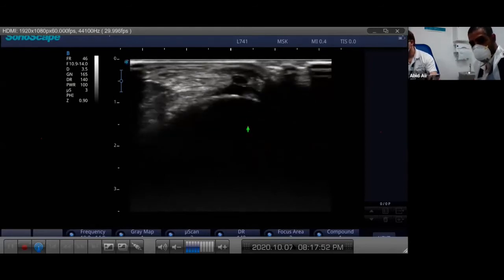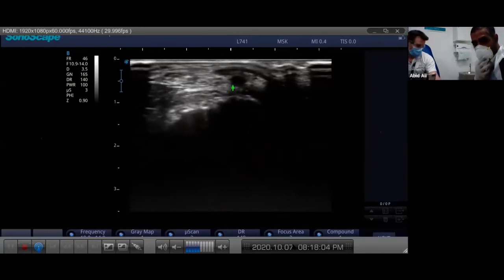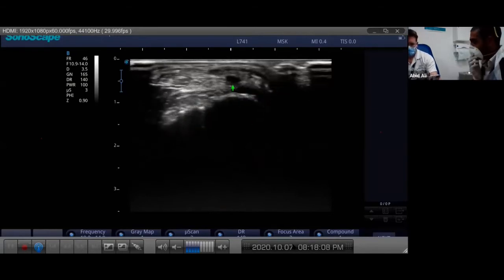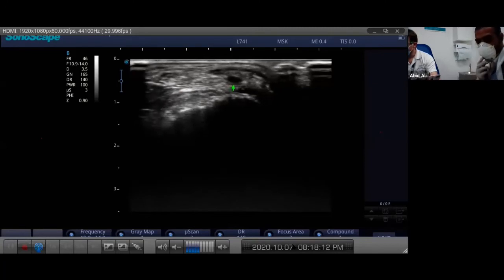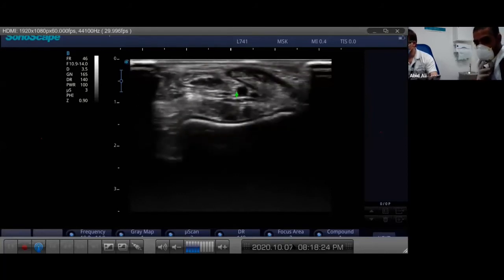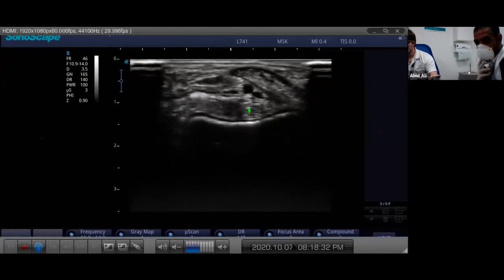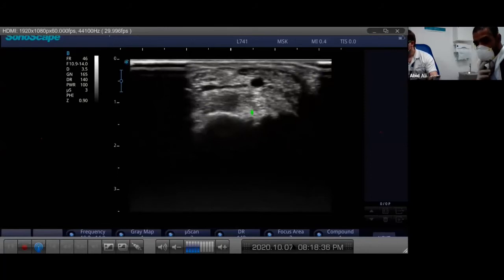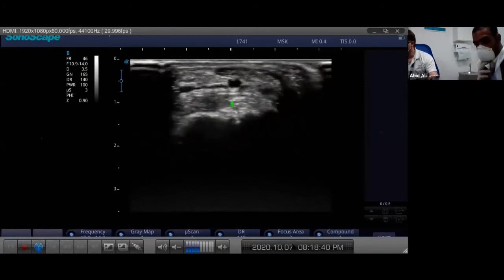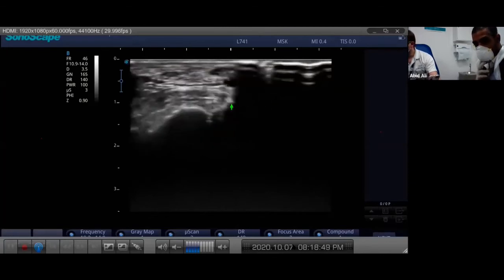If we're looking for the dorsalis pedis artery, you can see it pulsing away here. If you're trying to do a doppler exam and you can't quite place it, how simple is it to just put your probe on there and pick it up - you know exactly where you're going to go even in a foot with a lot of edema. You can still see a lot of structures with good equipment. You can see the extensor complex here, and the deep peroneal nerve - very nice to pick up if you're looking for nerve blocks.